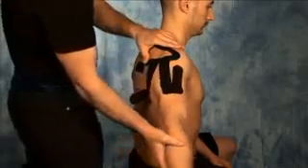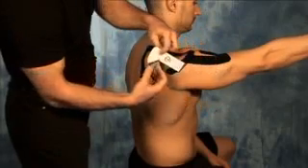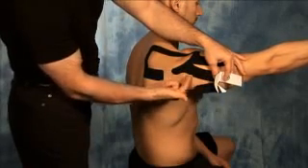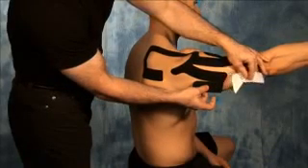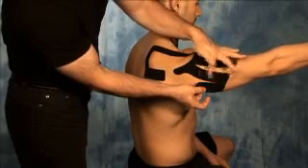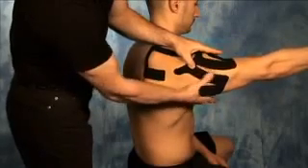Step number seven — bring the arm out in front, stretching the posterior deltoid. Peel back the backing of number seven, letting the tape come in gentle contact with the posterior deltoid. Let the remaining portion come off without any stretch on the tape. Gently rub the tape in. Once no creases are there, rub the tape a bit more aggressively to activate the glue.